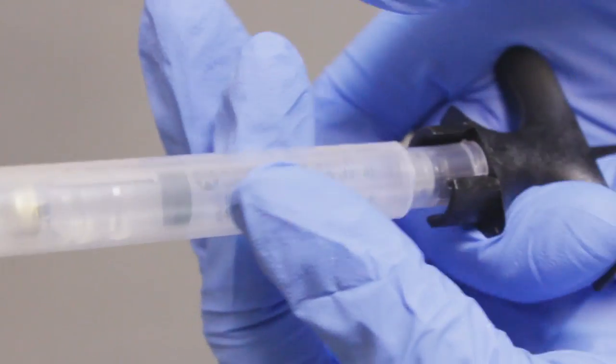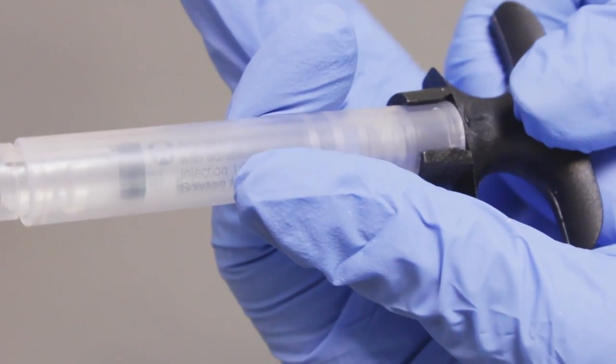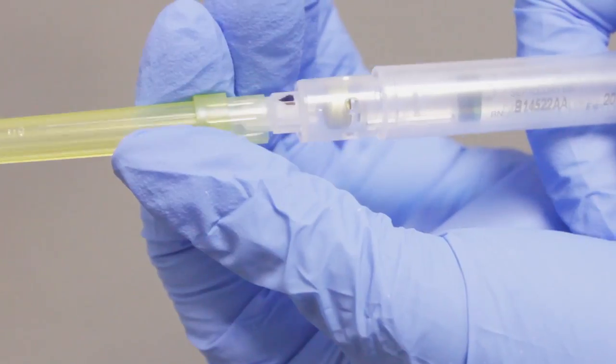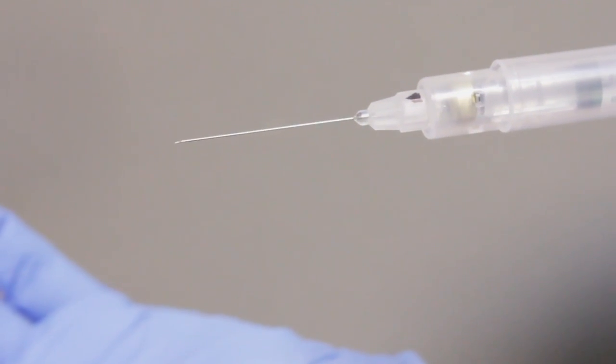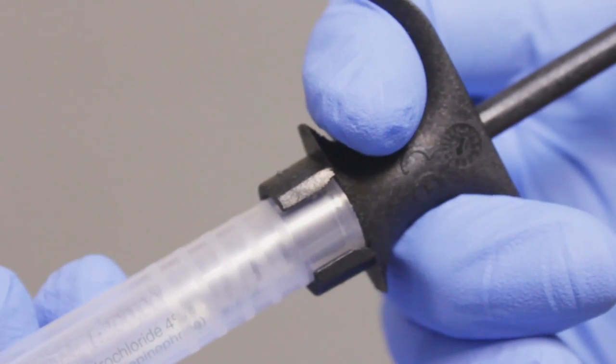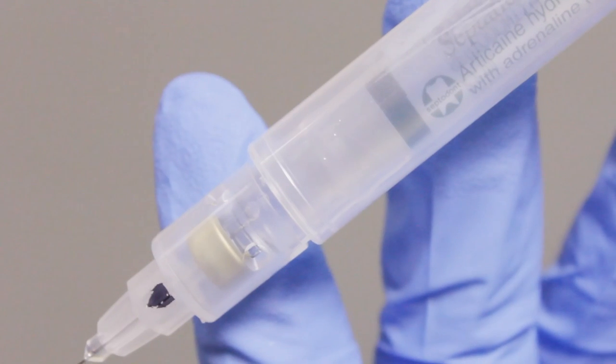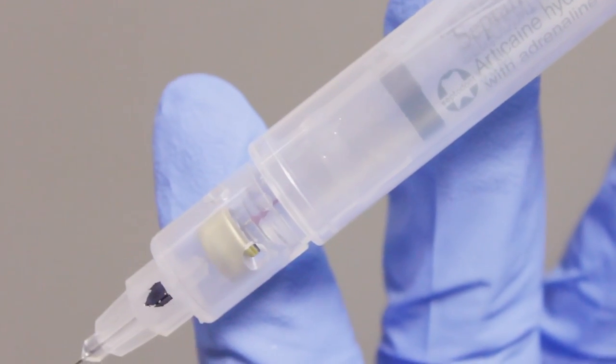Pull down the protective sheath until it clips and locks onto the handle. Ultra Safety Plus has a bevel indicator. When injecting, the bevel must face towards the bone. Apply injection pressure. Aspiration will occur when the injection pressure is released.